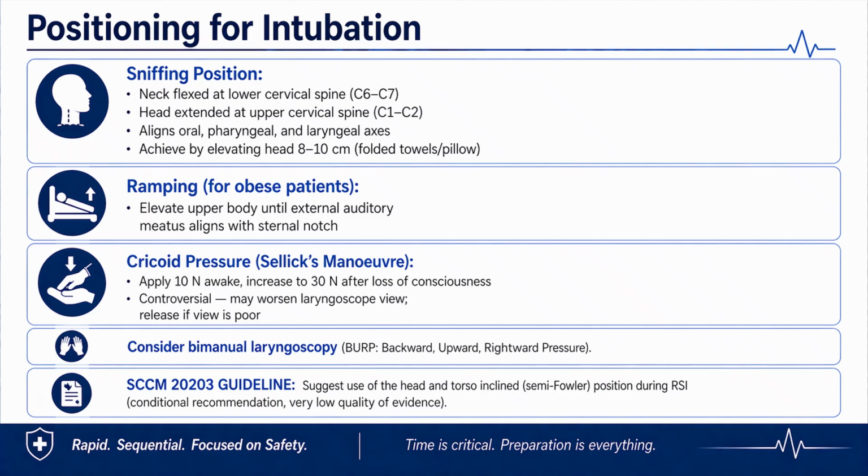Next P of our positioning. Remember, proper positioning improves glottic visualization and first pass success. So first, and most important, in positioning is the sniffing position. Sniffing position actually aligns the oral, pharyngeal and laryngeal axes.